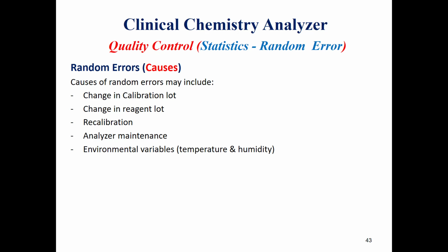As we said, this will help us to decide if our analytic system is reliable or not, and if the patient results are reliable and can be reported, in order to decide whether to prescribe medications, make a diagnosis for a certain condition, or make a plan for treatment based on the values of the analytes in our blood.